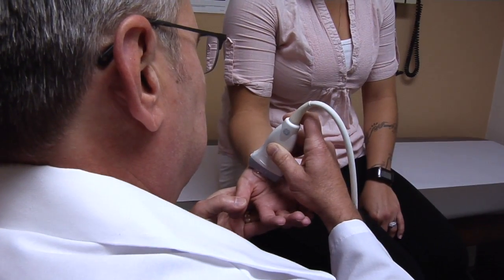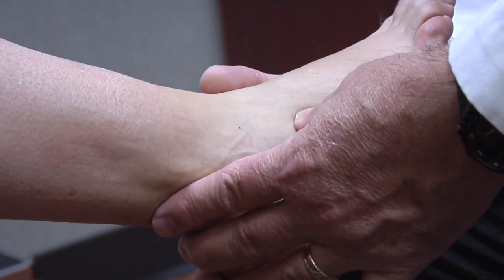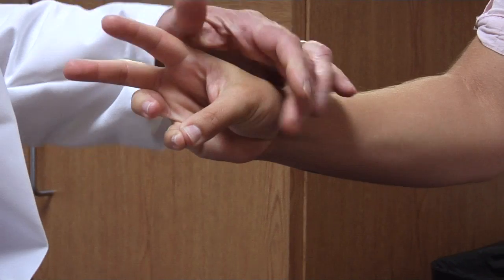Ultrasound guided injections are also useful for joints that are difficult to reach without visualization, like an ankle or finger joints.